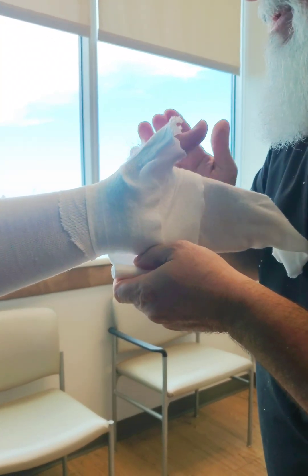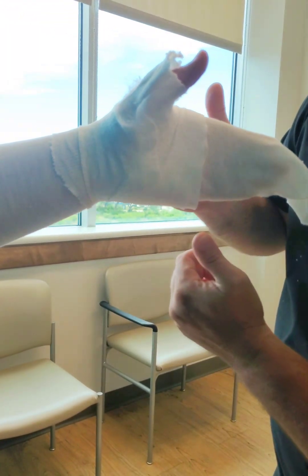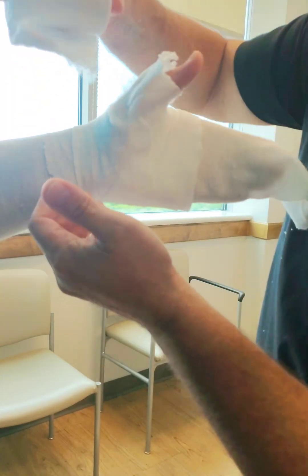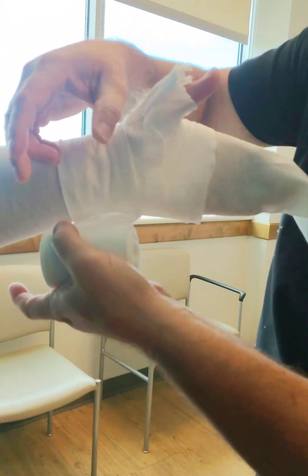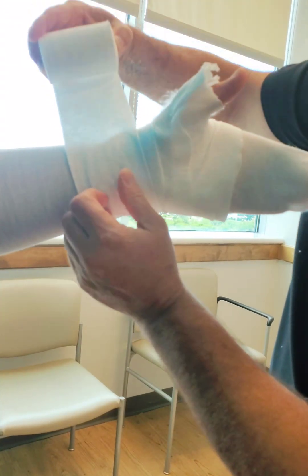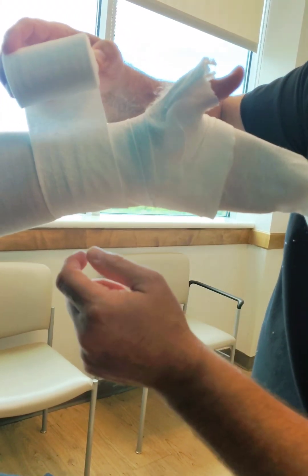If you notice — I'll stop right there. Now you've already started addressing the wrist. So now we just come through one more time and start working our way down the arm. You guys have already seen exactly how we work our way down the arm. We're going to finish this off like we always do, then come back and talk about the fiberglass next.